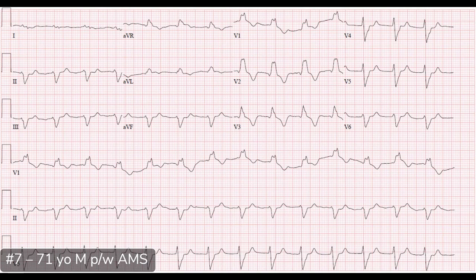This is a reminder about what a trifascicular block is. If you see this, the patient has a lot of infranodal disease and is at risk for complete heart block. If they present with syncope, pre-syncope, or even altered mental status, be very concerned that this patient may be experiencing intermittent complete heart block.